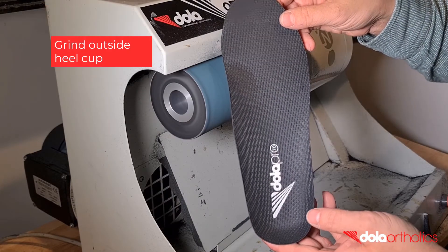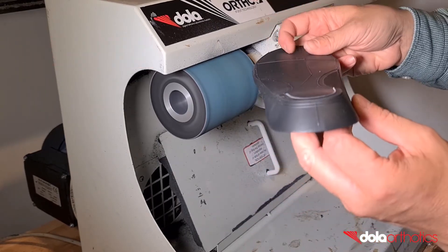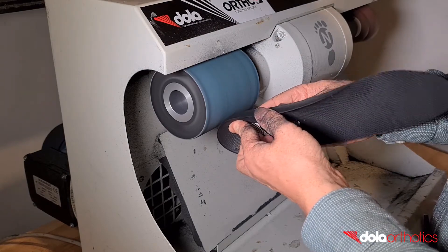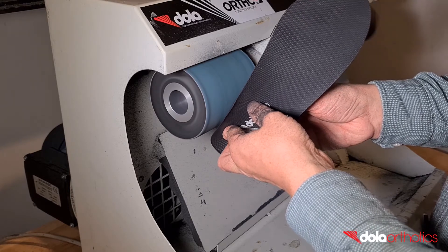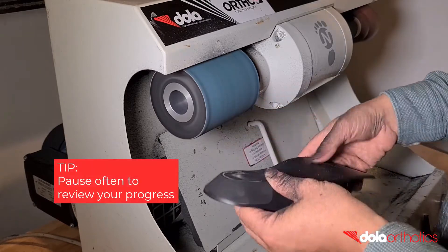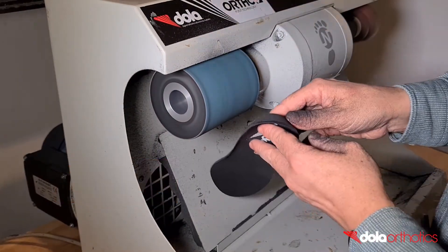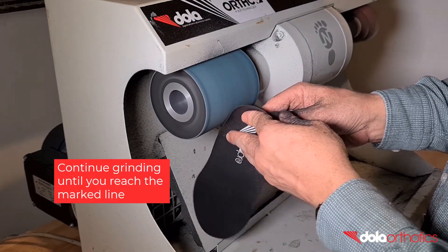The aim of grinding is to remove the orthotic shell material in the rear foot post taper grind area to your guideline. Keep the dorsal heel cup untouched and connect to the plantar marking by removing material from the plantar and outside surfaces. Hold the orthotic shell by the dorsal and plantar surfaces and place the plantar edge of the rear foot of the orthotic shell against the grinder. Angle the orthotic to remove material from the plantar and outside surfaces but not from the dorsal heel cup.